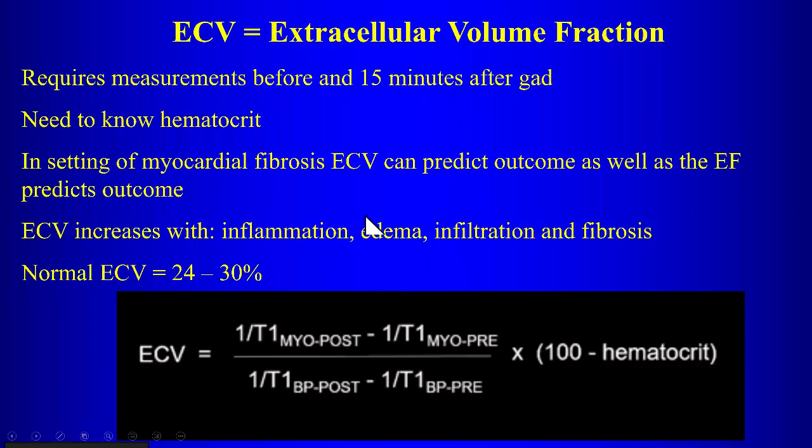Now, theoretically, this can be very powerful. One of the drawbacks, though, is that it does require the hematocrit, and it requires a recent hematocrit. Ideally, it should be one taken when the patient is there. It can't be taken 2 weeks before, especially in women who are menstruating, right? So that is one drawback of this method: it requires a very recent hematocrit to be accurate.